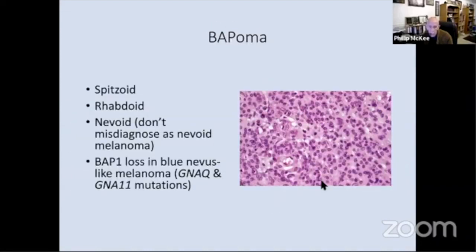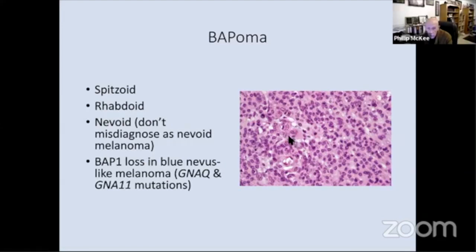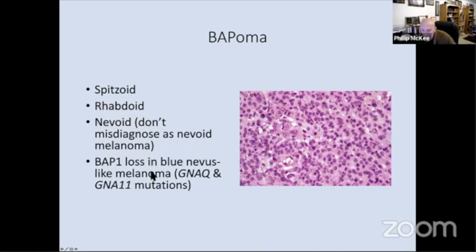Here's an important slide — this is a high power view of my first case. I put this in to remind you that what you sometimes think is a nevoid melanoma may be a BAP1 inactivated nevus. So it's important that you look at BAP1 expression in entities that you think might be a nevoid melanoma before you pull the trigger and make the diagnosis. The histology may be spitzoid, as I've shown you, or it may be rhabdoid. It's also worth noting that BAP1 loss may also be seen in blue nevus-like melanoma.